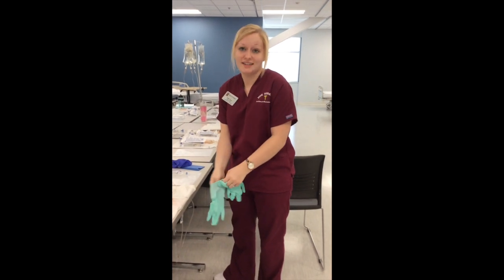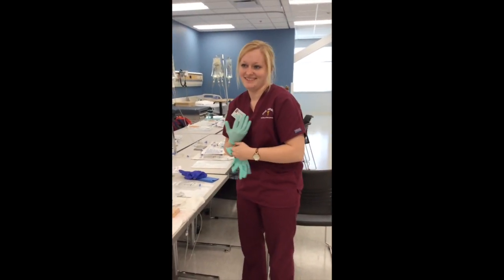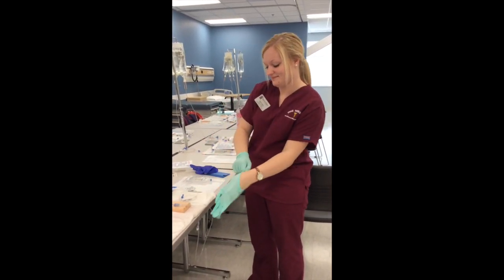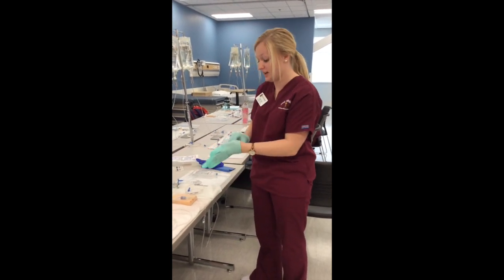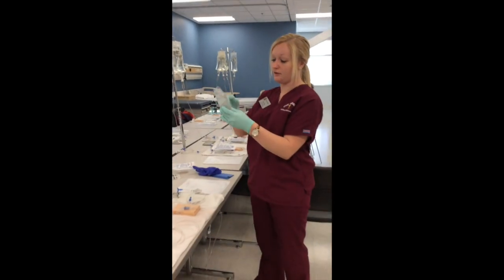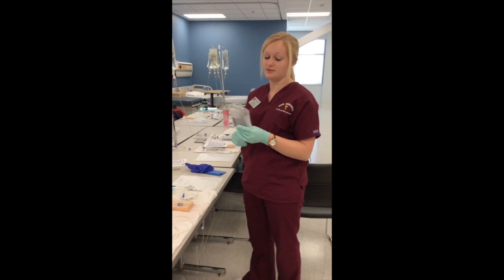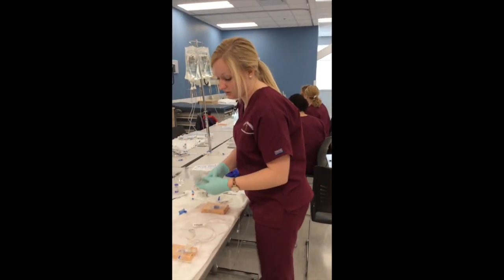And since I've already identified them with 2 identifiers, that's good. I'm going to go ahead and check, since I'm at the bedside, I'm going to check for the second time. Yes, levofloxacin, 500 milligrams, give over 60 minutes. I'm going to check all my patient rights, the 6 rights of medication administration. And I'm going to go ahead and prepare to hook it up.